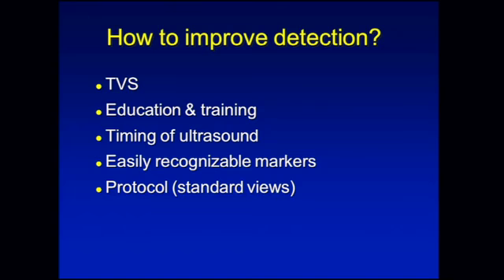Now I'd like to move on and discuss factors that allow us to improve the detection of fetal anomalies at 11 to 13 weeks.